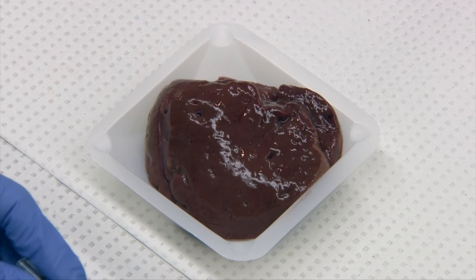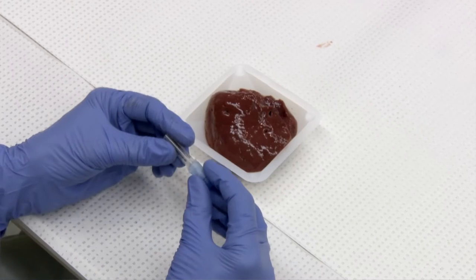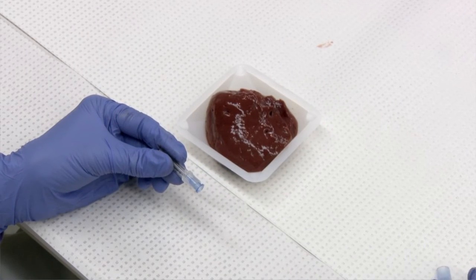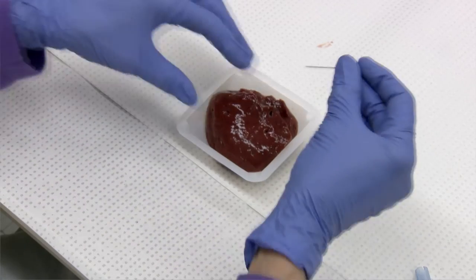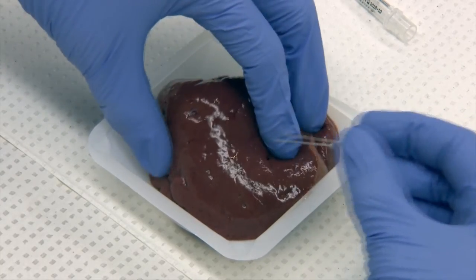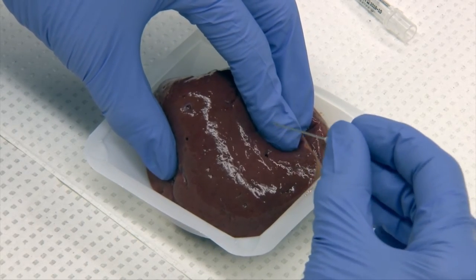There are some clinicians that prefer to do the non-aspiration method routinely. The first step is to take the cap off your needle, take the needle out, and have it ready to go. Then you will immobilize the tissue in your left hand, and you can do this on any mass. I have a piece of liver tissue to demonstrate here.